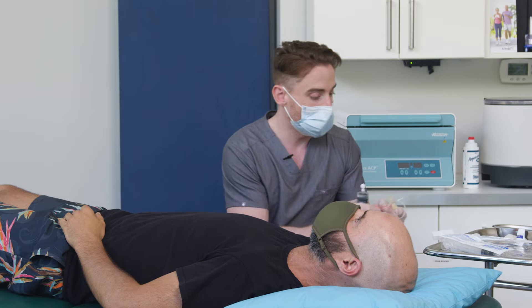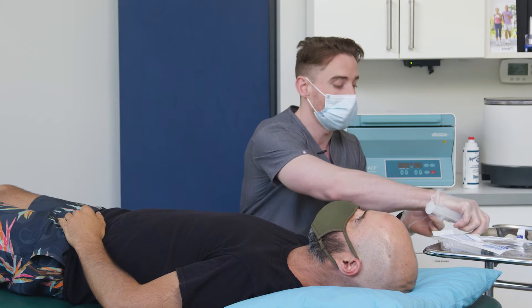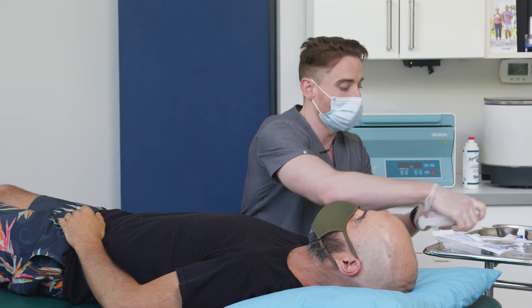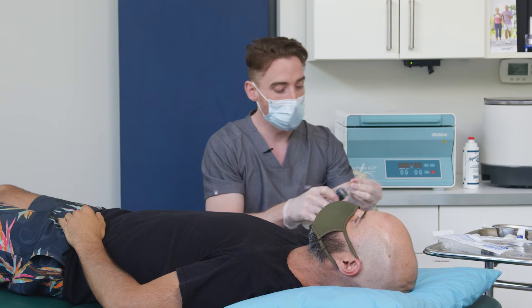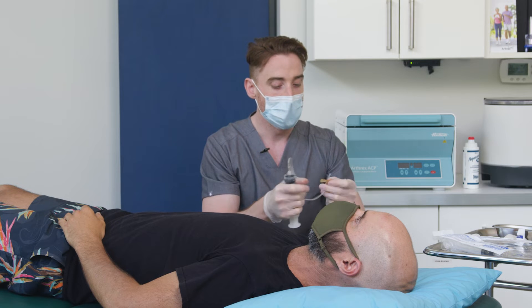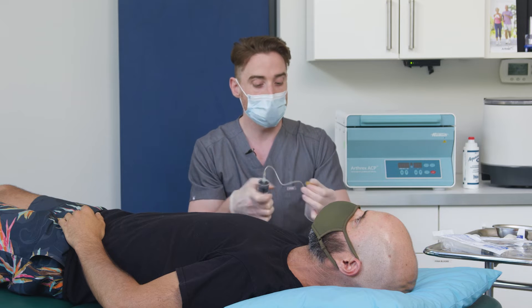However, this is one of the more concentrated products, which can help yield a beneficial effect from the PRP. Jaden has not had PRP in the past. He has had prolotherapy from Dextrose solution.